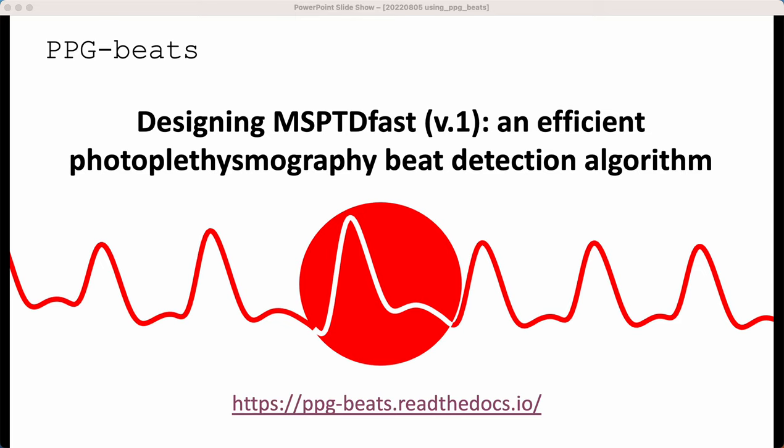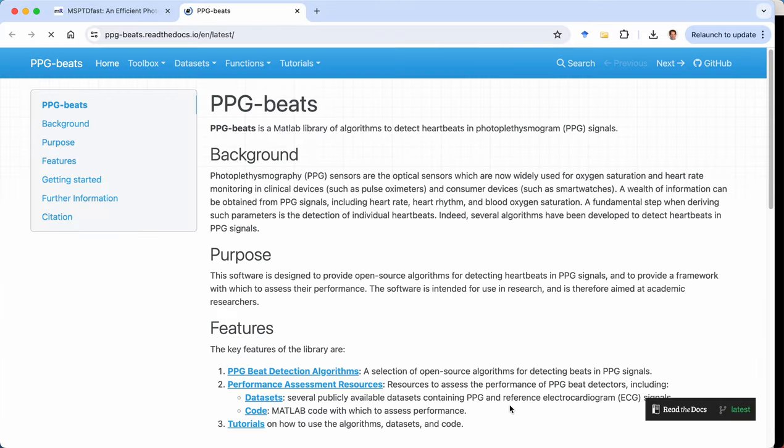Hello and welcome to this tutorial on designing a photoplethysmogram PPG beat detection algorithm. This tutorial follows the steps outlined at this website here. So let's go there now.